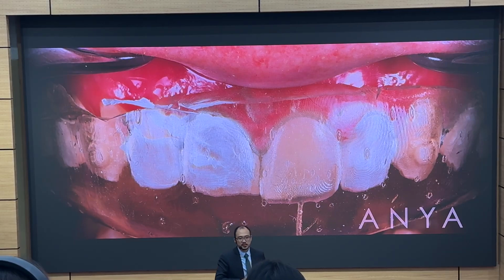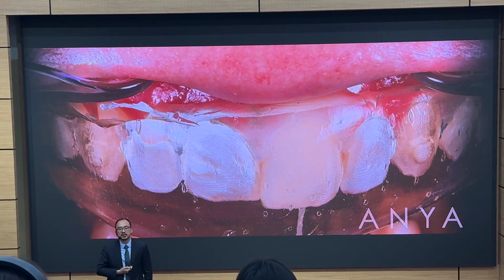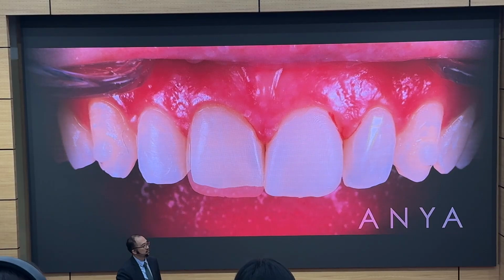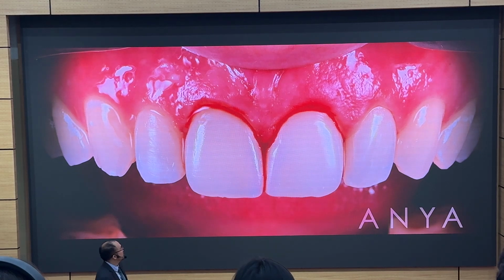And this allows us to inject the injectable material into the tooth really, really simply and predictably. And that's one tooth. We do the same thing on the other side. Inject. That's the second tooth. After a little bit of adjustment, polishing, that's basically it.